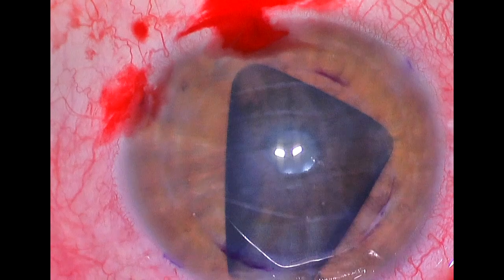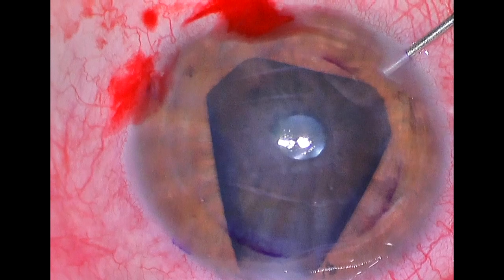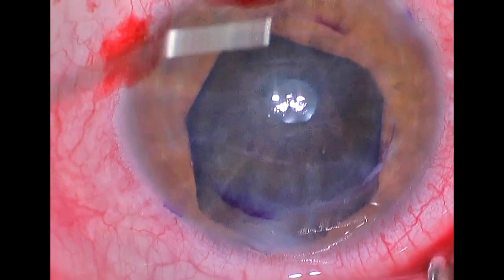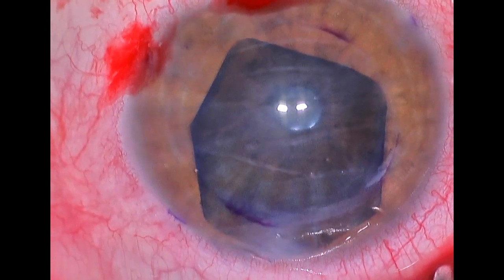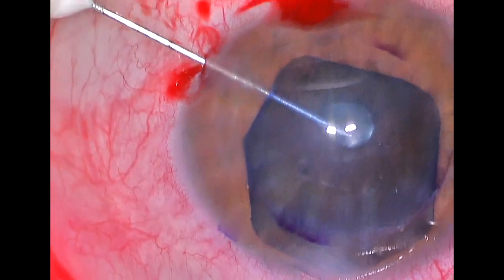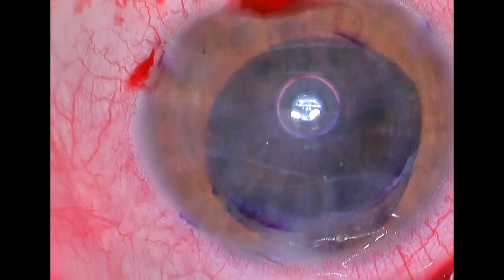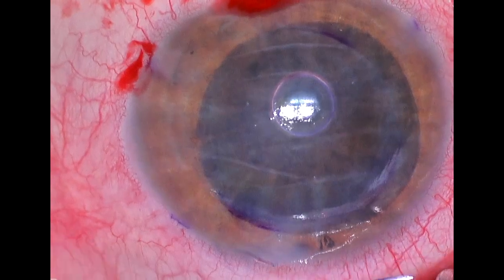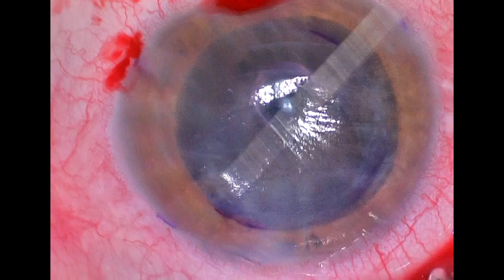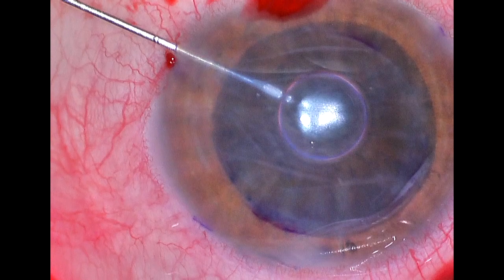Now that we know this graft is appropriately positioned, we'll try to center it a little better, and then we will use an injection of a very small amount of air placed under the graft to hold it in position while we move it further. It's difficult to move the graft if there is no air in the anterior chamber, because the graft tends to just scroll more easily. That small air injection helps to unfold the graft and pin it to the back of the host cornea while we get it centered over the area of tissue we removed at the beginning of the case.